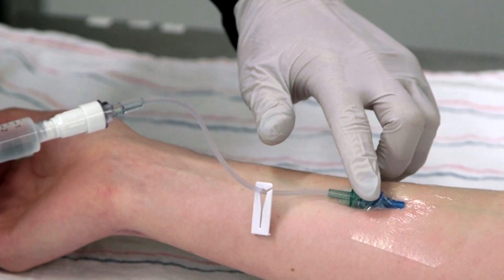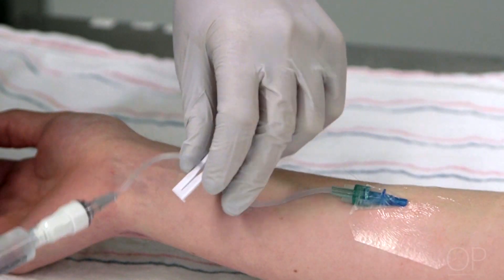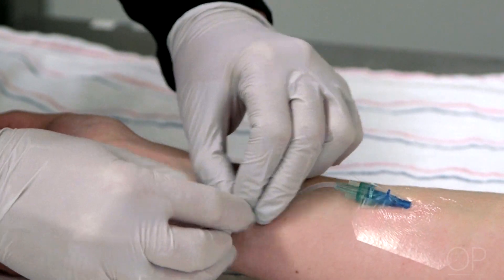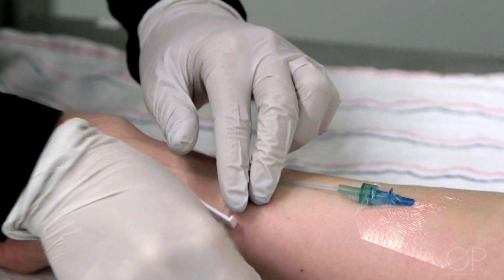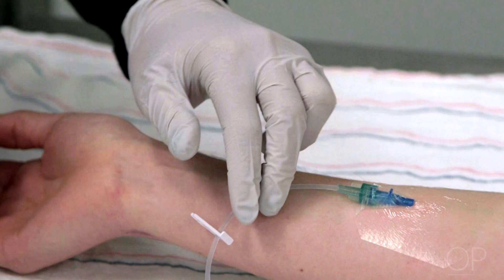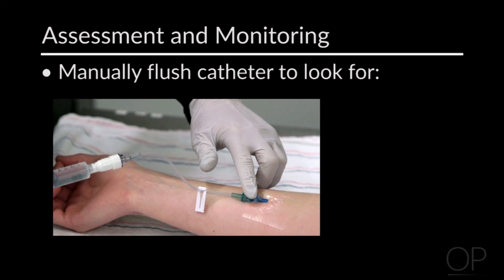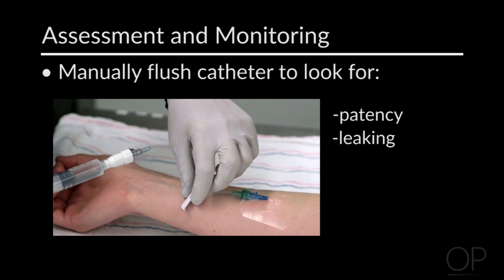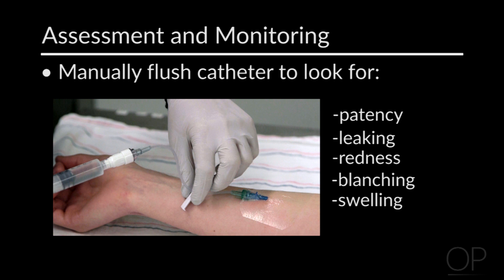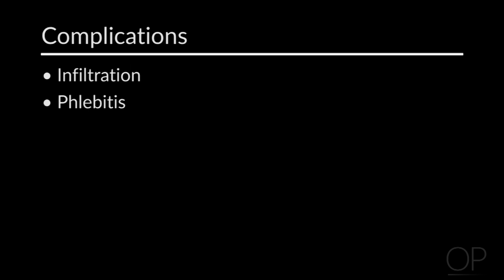Before using the IV, make sure it is patent for either continuous or intermittent use. If the infusion is continuous, monitor the IV site at least every hour. Once the IV is placed and deemed patent, place an occlusive dressing that allows for visualization. Manually flush the IV catheter to check for patency, leaking, redness, blanching, and swelling. Check the IV site frequently for patency or signs of complications, which can include infiltration, phlebitis, dislodgement, leaking, or loss of patency.